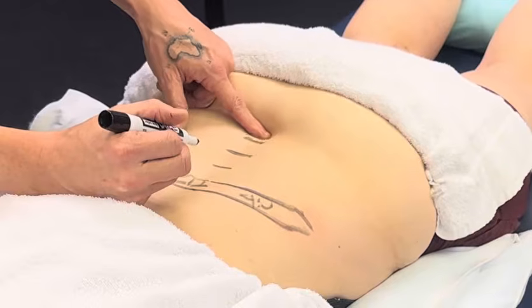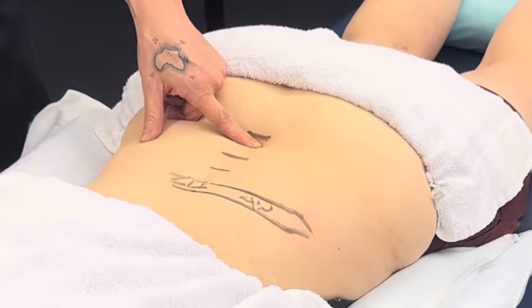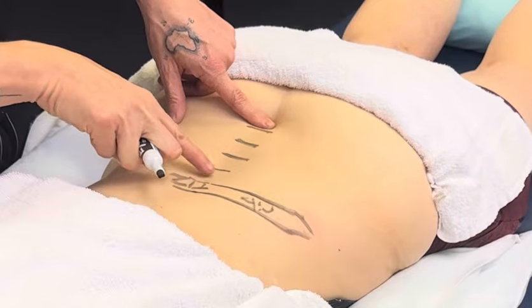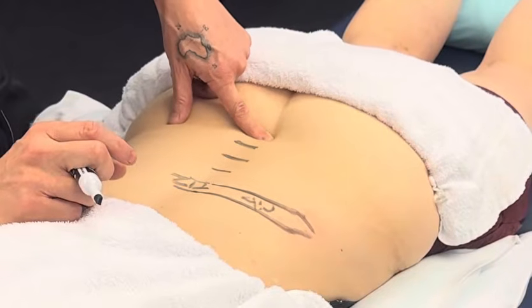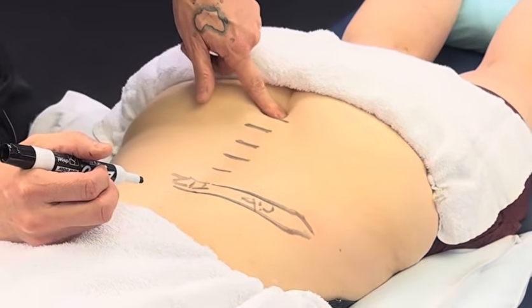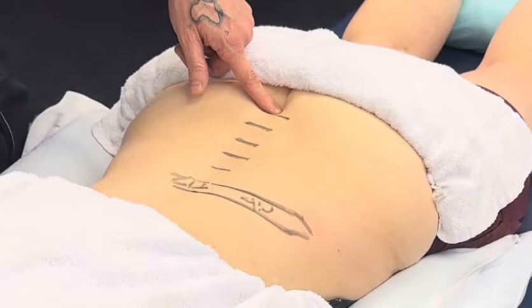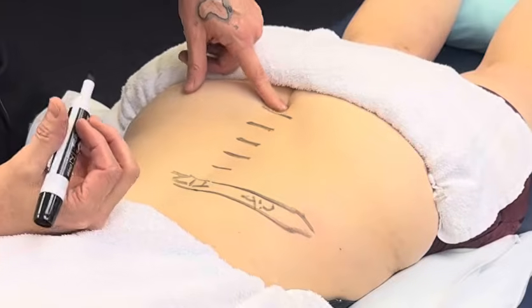You don't have to be this accurate with your anatomy drawings to be able to needle in here. This is just for y'all's benefit, okay? This last one, sometimes it can trick you because this is L5. Sometimes if you come onto the sacrum, there's a bump there, and you can mistake that for another spinous process.